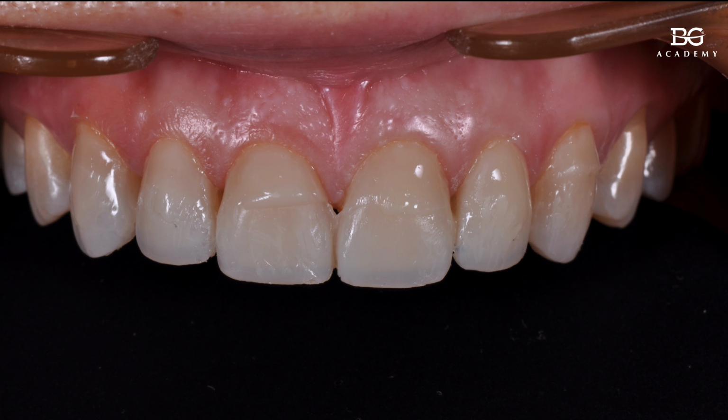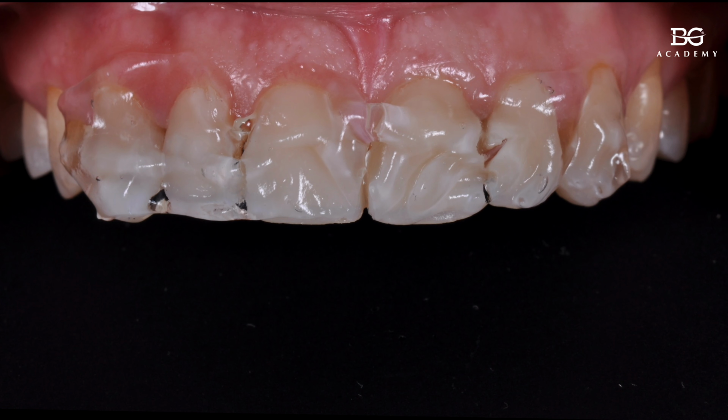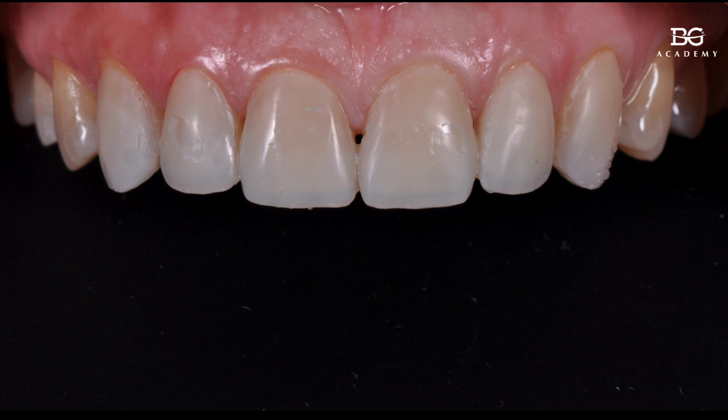So here you can see the already added portion of composite, freehand. Okay, it takes time to be honest, but if you know how to sculpt your composite restorations, it will be relatively fast in your hands, I think. And then we just do the finishing and polishing procedure. We do our final polymerization using glycerin gel, for example, and you have your temporary composite veneers that your patient will wear for, I don't know, 1 week, 2 weeks, 20 days, and then you will bond your final ceramic restorations.